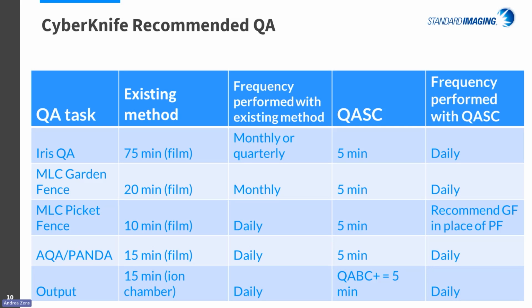So now that I've covered the patient-specific QA portion of this webinar, let's switch gears to the CyberKnife machine QA. As I stated at the beginning, if you're doing this plan QA, you also have to be sure that the system is mechanically functioning at its best in order to be positioning that robot accurately for those precise treatments. So, performing stereotactic QA on a daily basis helps ensure that machine uptime is available and it meets the recommendations of the task group 135B.